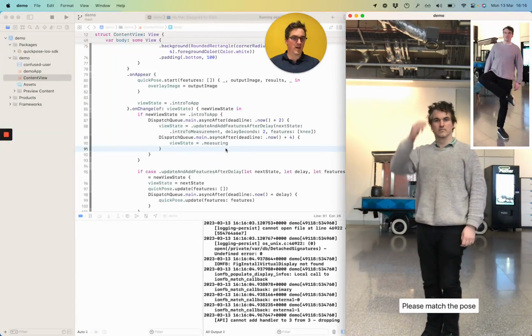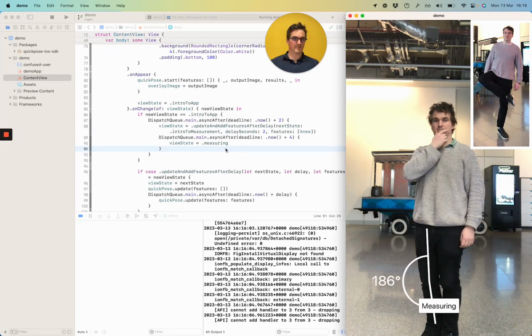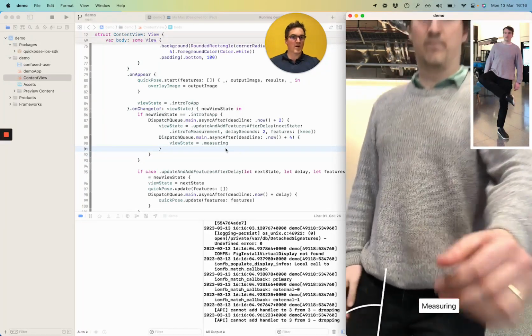Welcome to the leg measuring app. Please match the pose. Cool. Okay. Right, I'm happy with that.